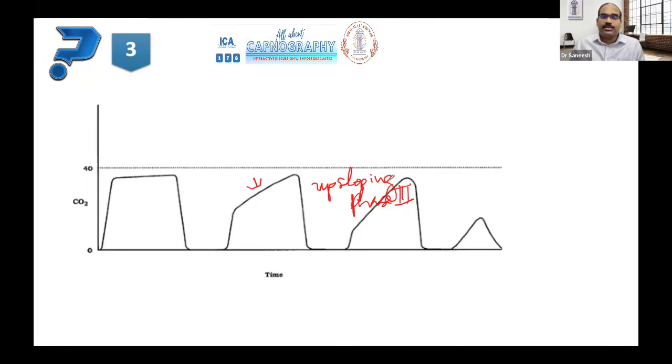But in scenarios like acute bronchospasm, the low V/Q areas or high resistance areas will release carbon dioxide later. So the carbon dioxide values towards the end of expiration pick up pace. Initially, because of the expiratory flow limitation, less carbon dioxide is released.